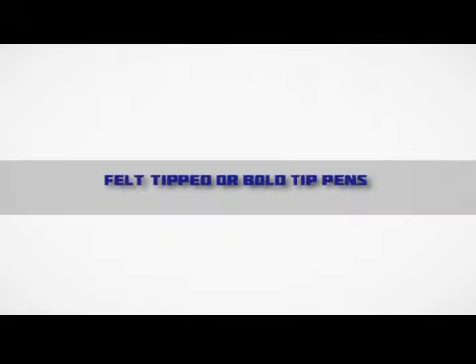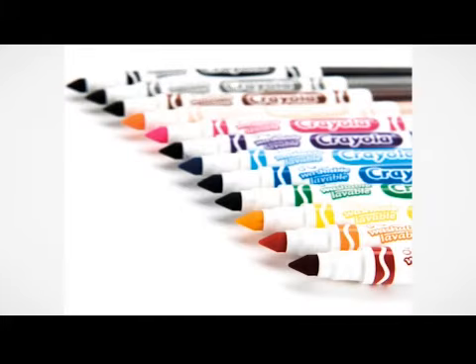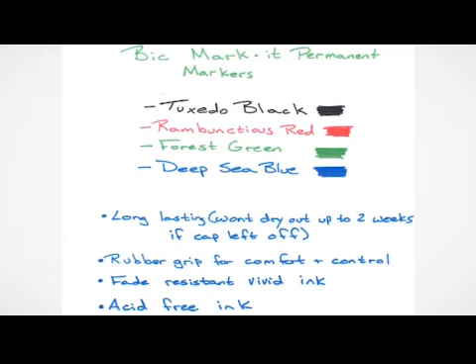Felt tipped or bold tip pens. The larger or bold tip writing pens form larger letters so that a low vision person can read letters and words more easily. In order to find the pen that works best for an individual, try experimenting with several different brands and tip thicknesses until you find one that best meets the writing needs. The writing spaces between lines can range from ½ inch to 1 inch.